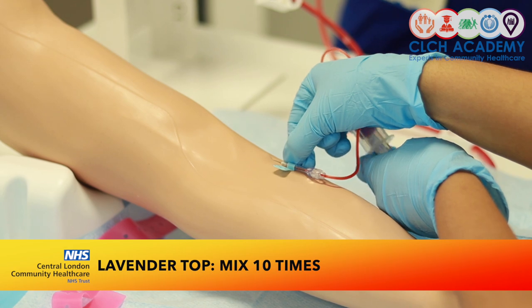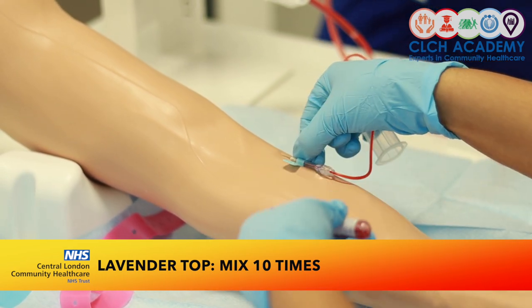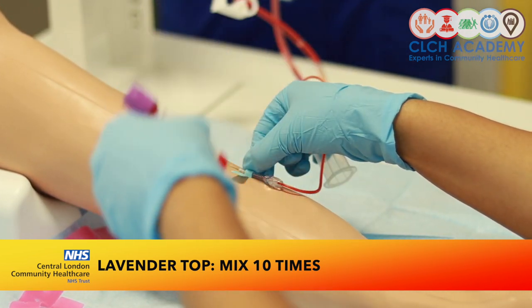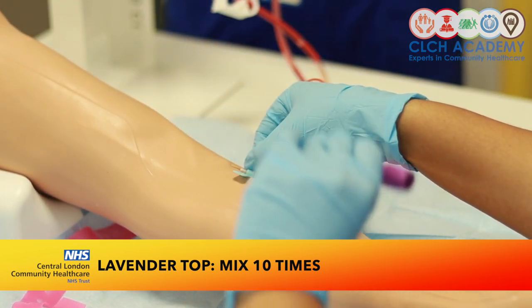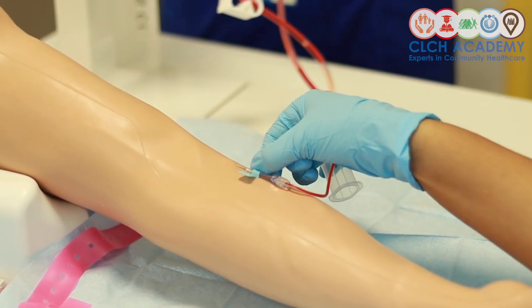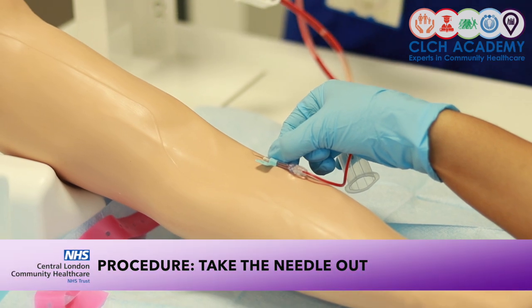Right, I've got sufficient for that. I'm going to do my inversions, 10 for this one. And 7 and 8 and 9 and 10 inversions. Popping that down. Now I'm ready to take my needle out.